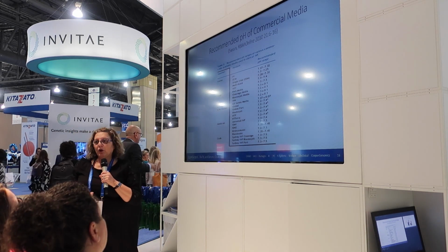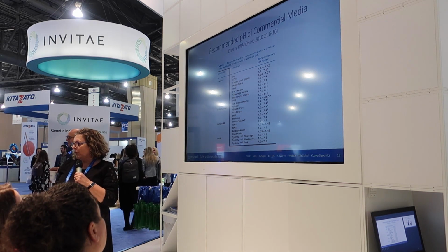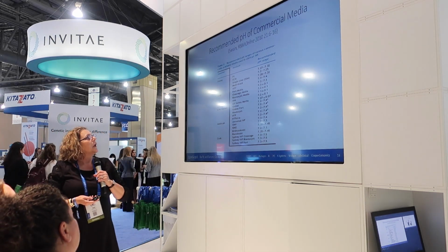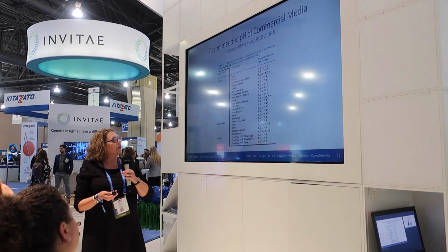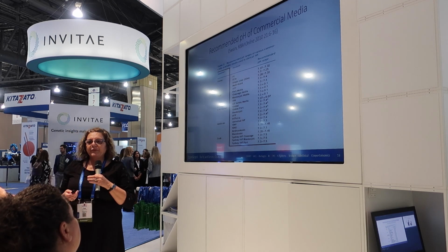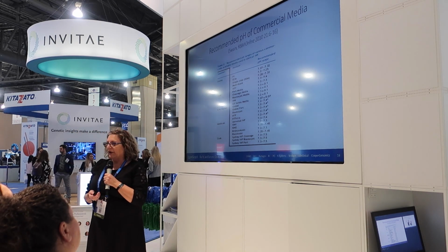This is some work from Jason Swain. You want to see that not all culture media are created equal as far as pH, so you really need to know what kind of culture medium you're using. They're different between Sage and Irvine and Vitrolife and Life Global. So really be aware of the type of media that you're using.